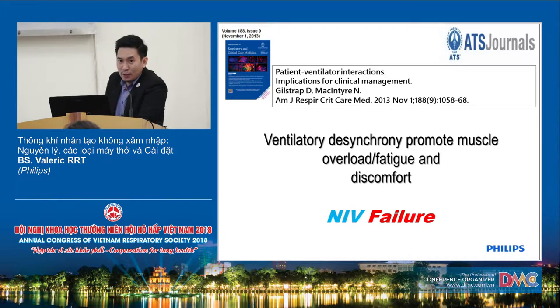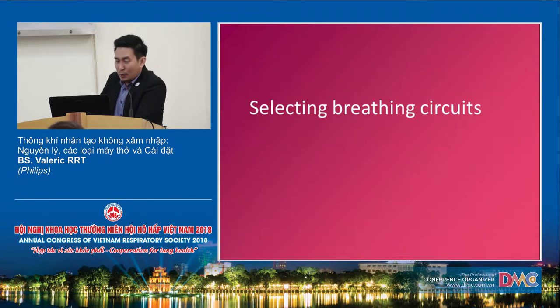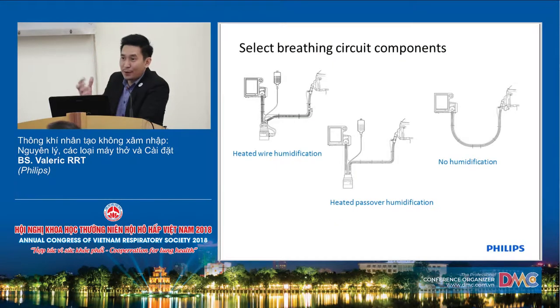So I just want to give you some overview. Additional information: selecting breathing circuits. In dealing with non-invasive ventilation, I highly recommend using humidifiers with water, heated humidifiers. I discourage using an HME filter if you're using our Philips single circuit non-invasive ventilation.